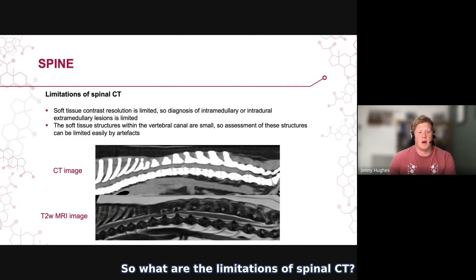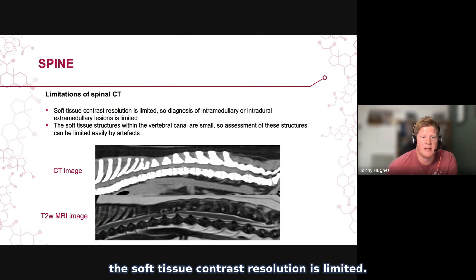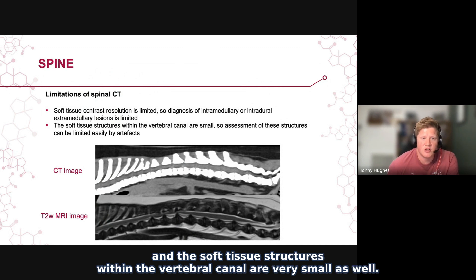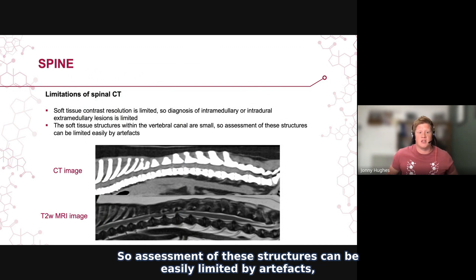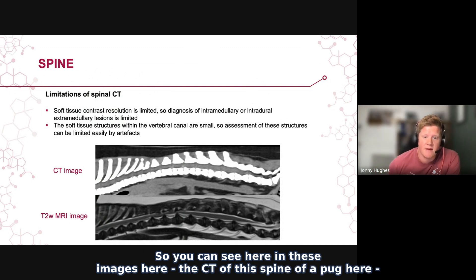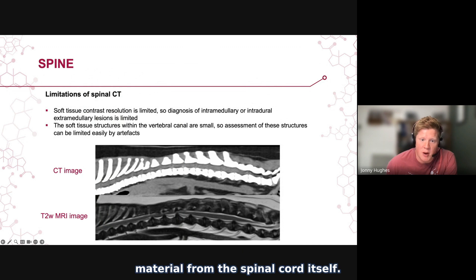What are the limitations of spinal CT? When trying to assess the spinal cord, the soft tissue contrast resolution is limited, so diagnosis of intramedullary or intradural extramedullary lesions is limited. The soft tissue structures within the vertebral canal are also very small, so assessment can be easily limited by artifacts in combination with that limited contrast resolution. As seen in these images of a pug's spine, it is very difficult to differentiate intervertebral disc material from the spinal cord itself.